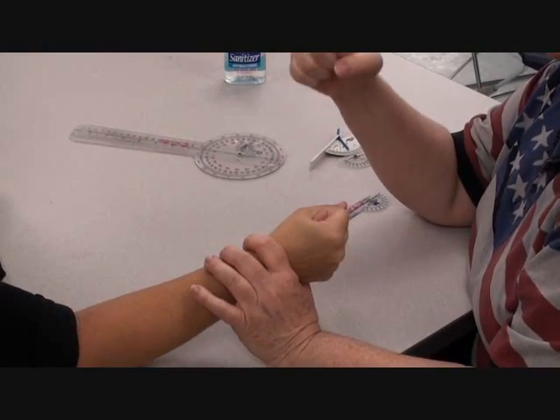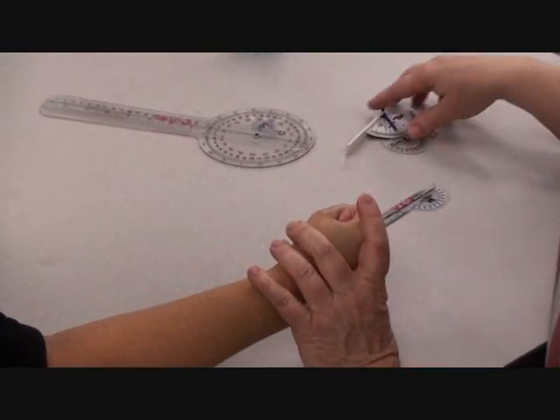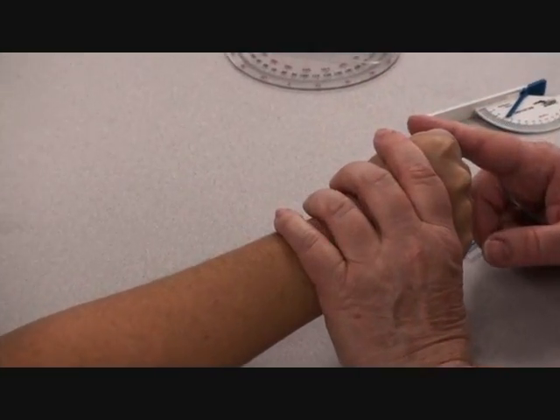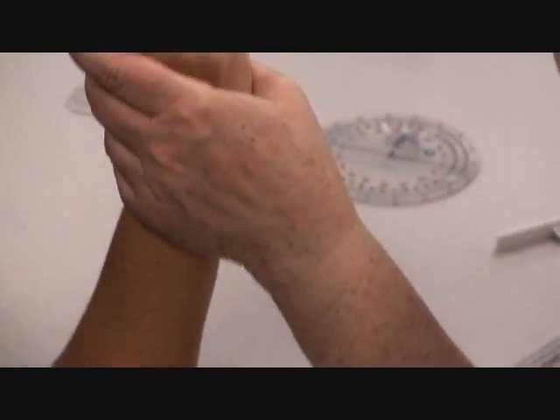So go ahead and show me full fist. Okay. So we said with measuring the MPs, well actually, go ahead and let's do one extension. You've got some hyperextension.